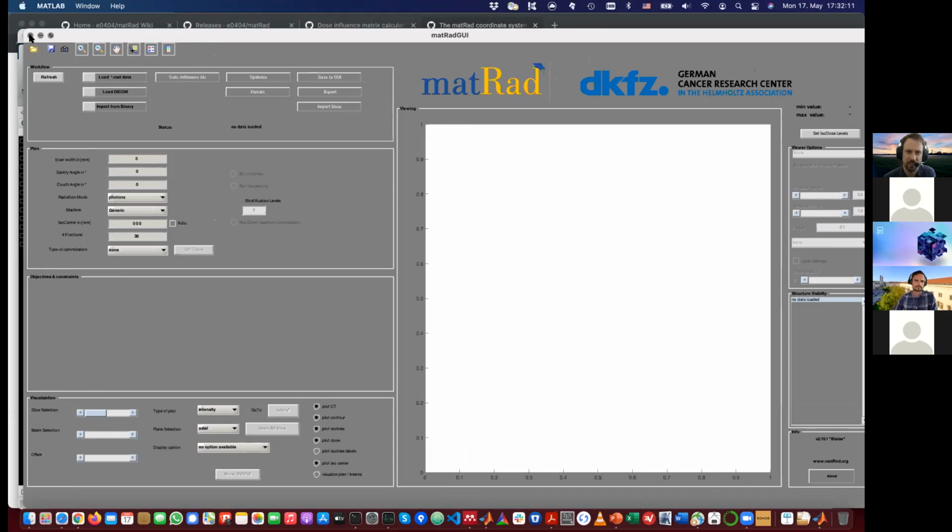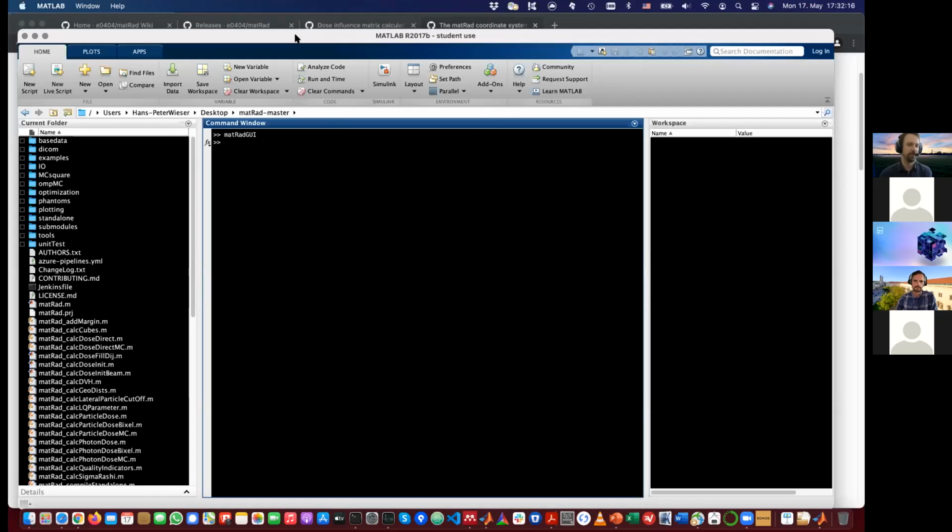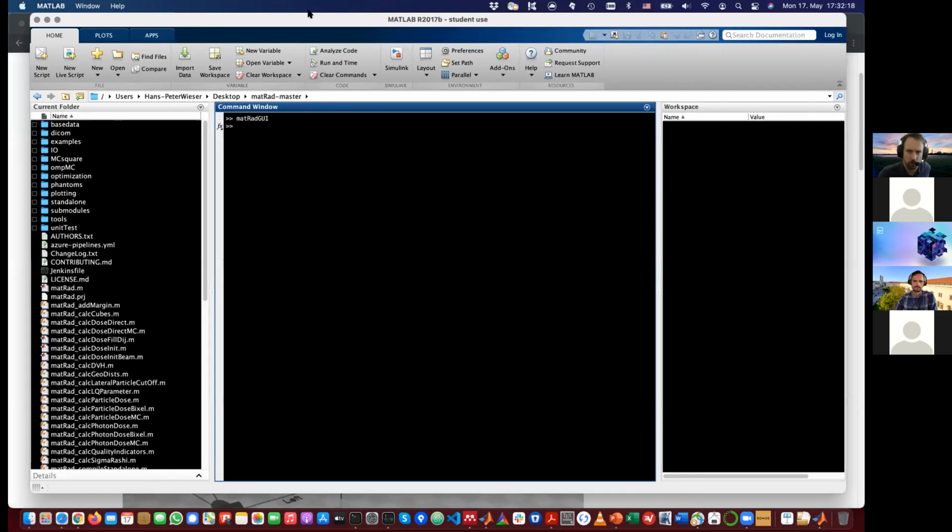We don't have DICOM data, right? So no, I don't have something on my computer that I want to import and show you. It's my home computer. I don't really have patient files here. And also, if I had patient files, I wouldn't want to import them, because they may not have agreed to sharing their data and CTs publicly.